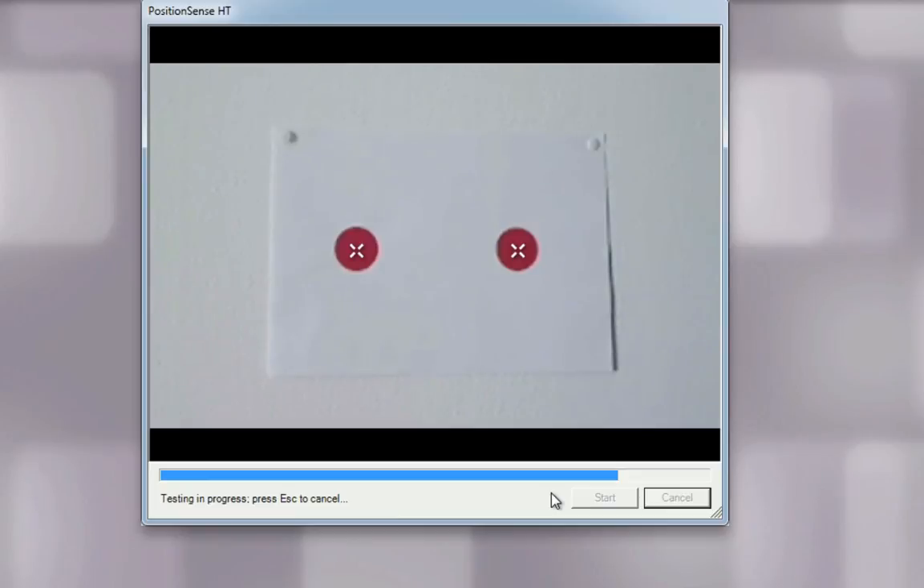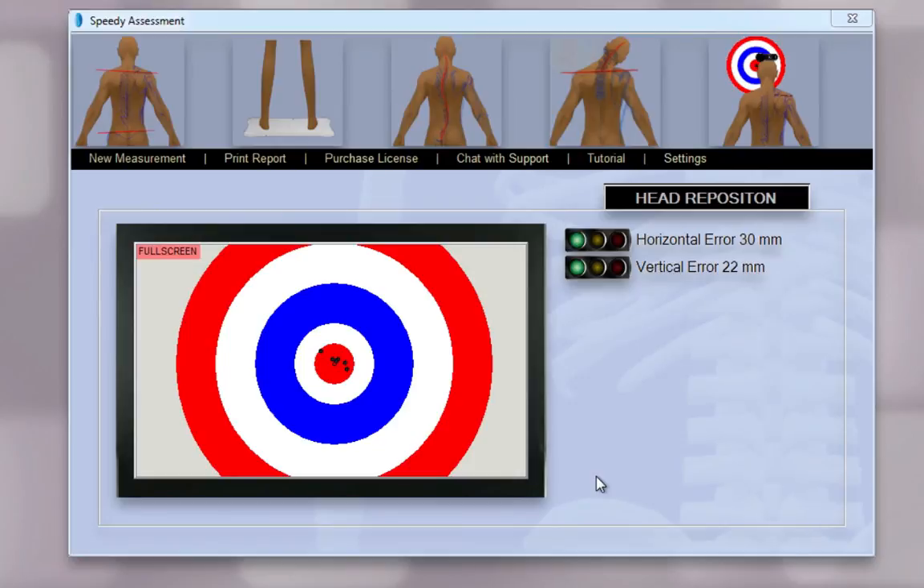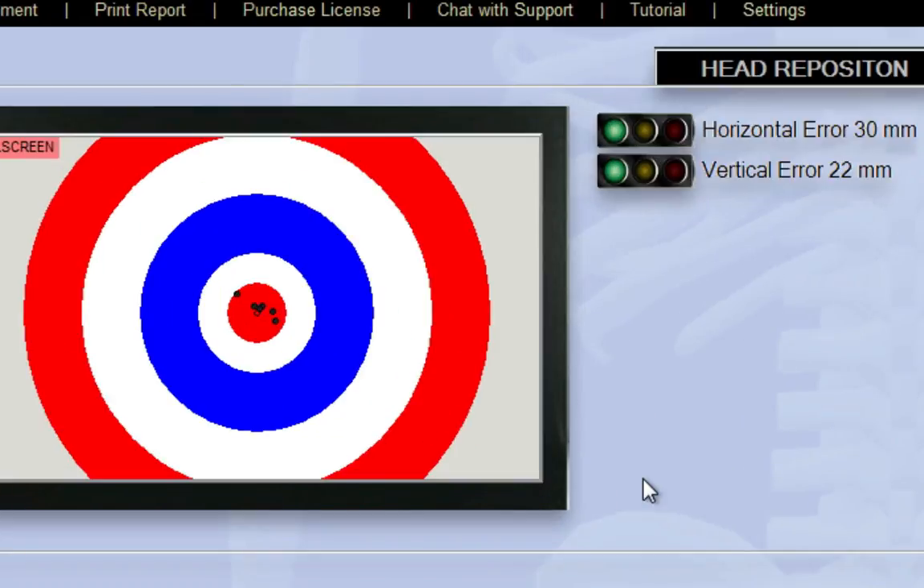The test is completed — press Close. Here we can see the results: the horizontal and the vertical errors. That was all. Please remember, if you need any help, just click on the chat with support icon. Good luck.